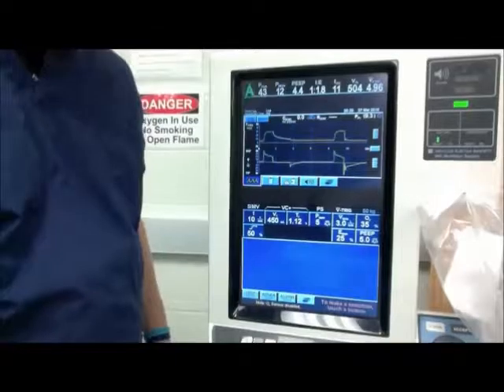We also want to look at her physical assessment. She has no increased work of breathing, no accessory muscle usage. She's not agitated. She's certainly not obtunded. She's not somnolent, and she has really good color. We can also look at the vent and make sure that she has good volumes within normal limits of her baseline. So at any time I see a respiratory distress from her, I would stop the weaning process and return her settings back to where she was prior to the weaning process.